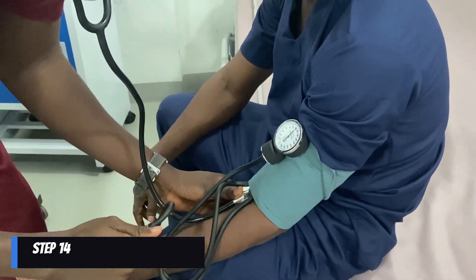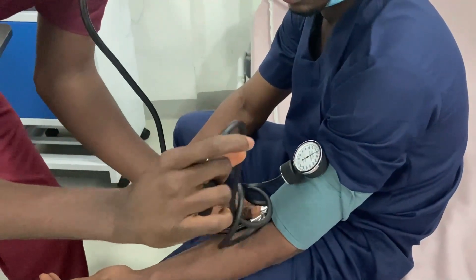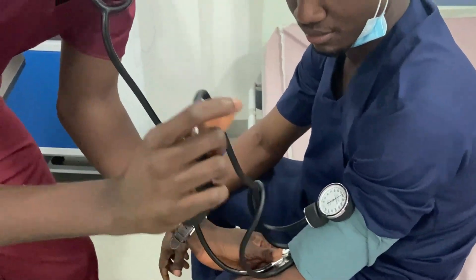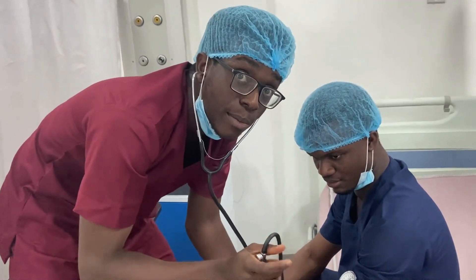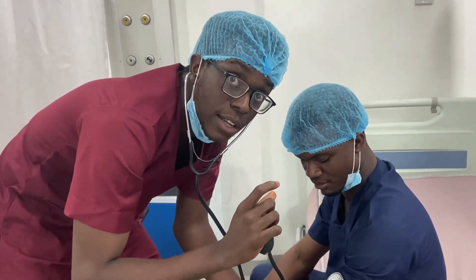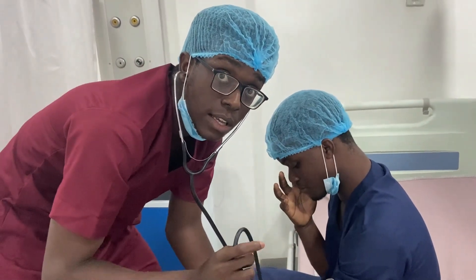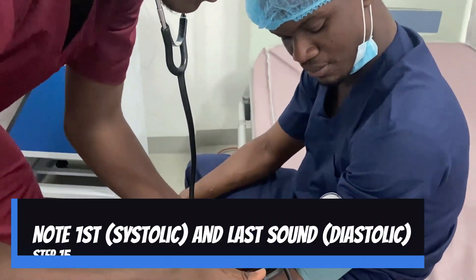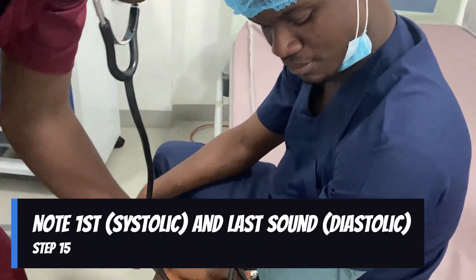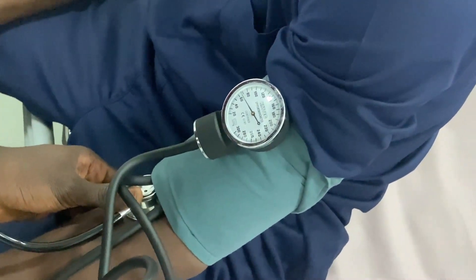When you're doing this, the first point where you start hearing the Korotkoff sound — those tapping sounds — that is the systolic blood pressure. When those sounds end as you continue slowly deflating, that is the diastolic blood pressure.